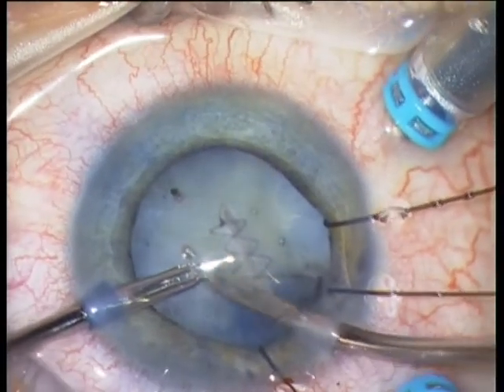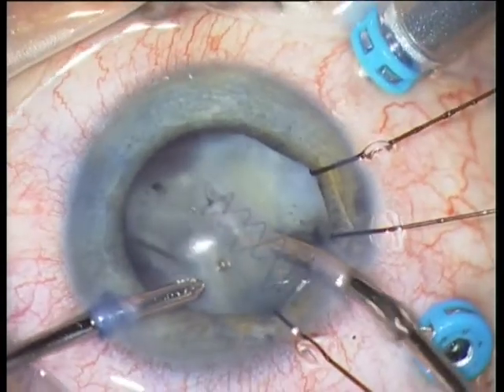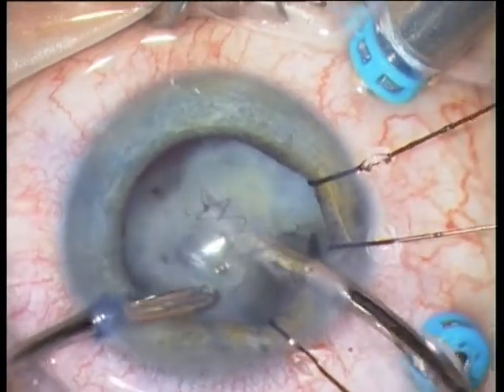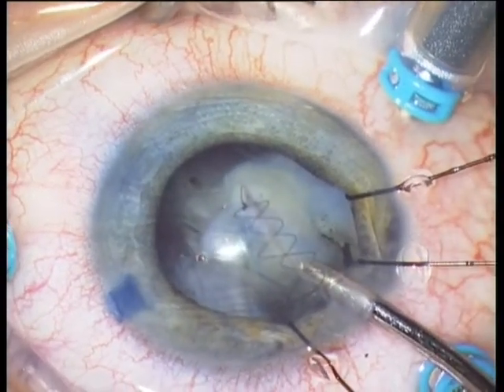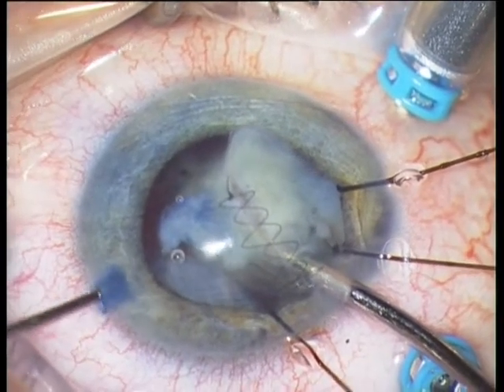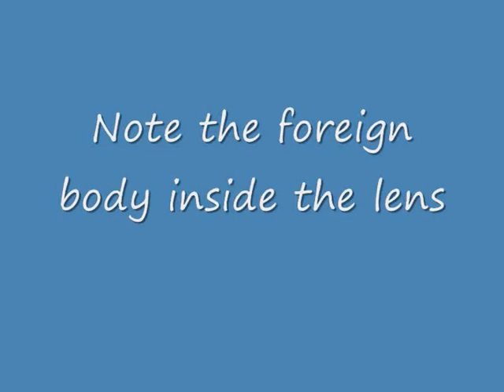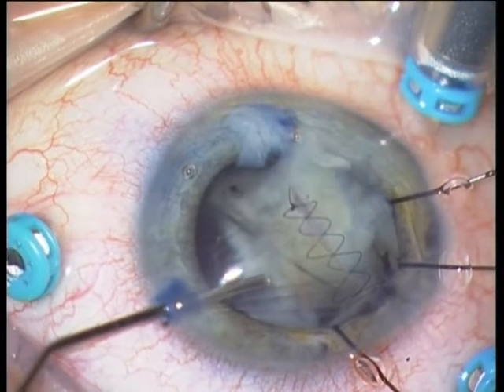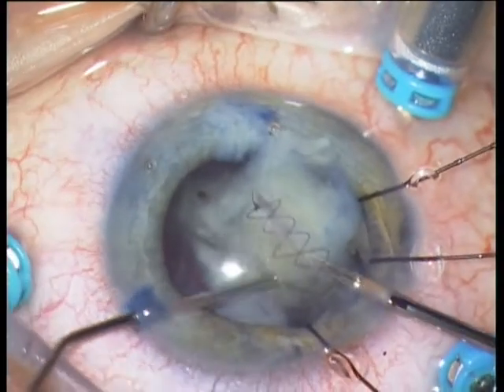It is sufficient to use irrigation and aspiration because the lens material is soft. Note here there is a foreign body at 1 o'clock, 2 o'clock, which is usually not inside the nucleus. So I will try to extract this foreign body and I am injecting now viscoelastics to inflate the lens capsule. Then I am taking the 23 gauge Eckert end-grasping forceps to extract this foreign body.